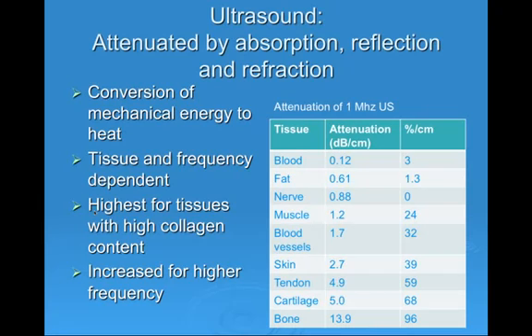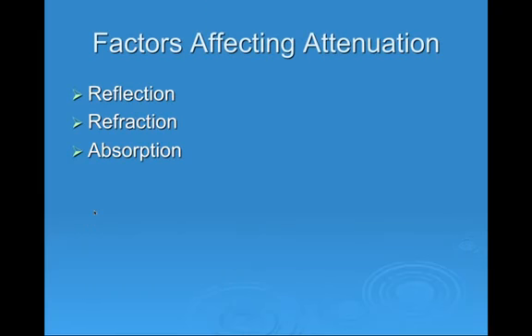All right, so again, this tells us a little bit about what type of materials we want to be applying our ultrasound to in order to get a heating effect, and that's things that have collagen in them. Okay, so if we're going over fat, it also tells us that we're not losing a lot of energy, but it also shows us that we probably should not be using this for trying to heat muscle. Okay, especially not over a broad area of muscle.